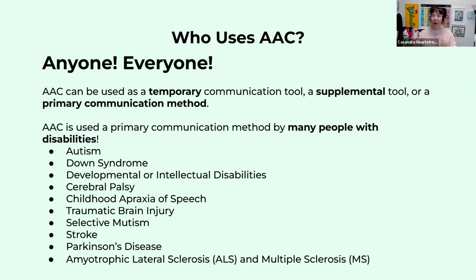So thinking about temporary, if, for instance, a couple of years ago, I had dental surgery and I had to keep my jaw still for 2 weeks. No talking, no solid food. And so at that point, AAC became a temporary solution for me. I brought it to work. I participated in IEP meetings with my high-tech AAC device.